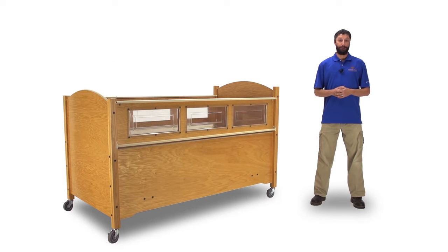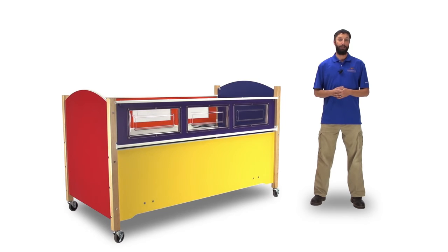We offer our beds in natural oak, maple, cherry, and mahogany, as well as a variety of colors. You can mix and match or choose one solid color.